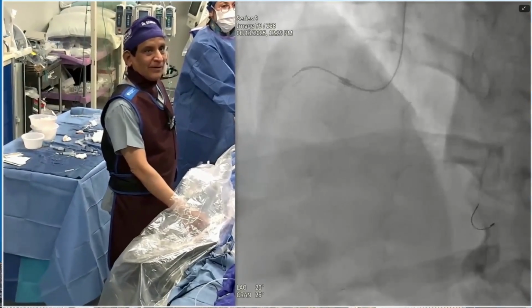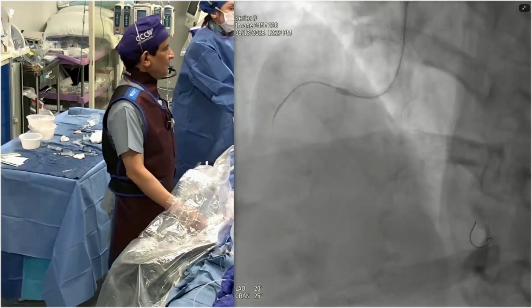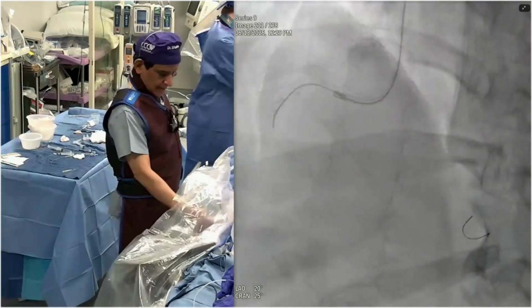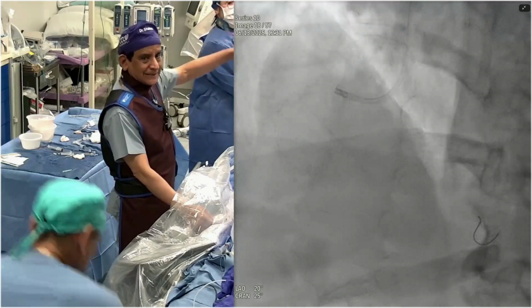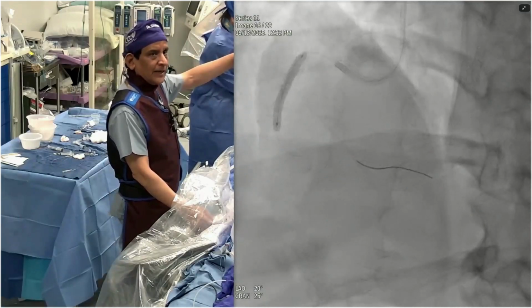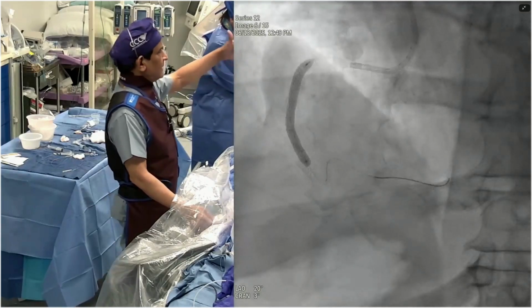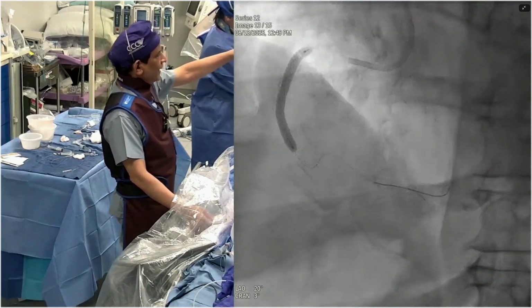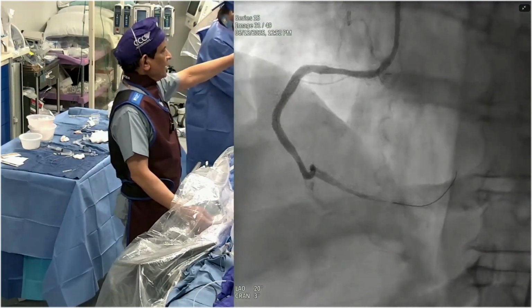Okay, all right, guys, that's where we left you. We were doing the orbital atherectomy for that 360-degree calcium in a large vessel. After that, this is the result, which showed a little dissection line, which is common. Then we post-dilated with a 3.5, 30 high pressure, and it came out perfect. The whole issue was advancing the guide liner, and therefore it required a little time. We went back and were able to put the guide liner there, post-dilated, and you can see a fantastic result.